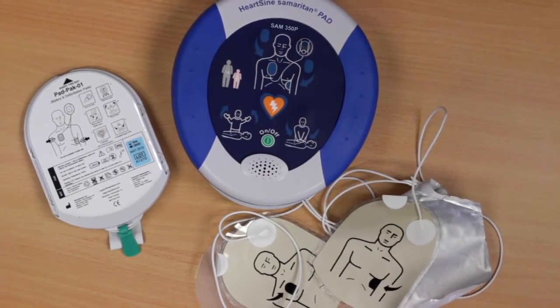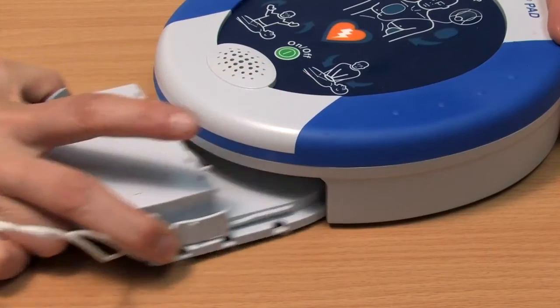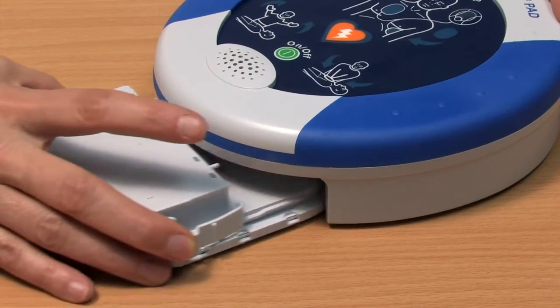After you use the PAD, you will need to replace the pad pack. To remove the pad pack, squeeze the tabs on the sides and slide it out of the PAD.